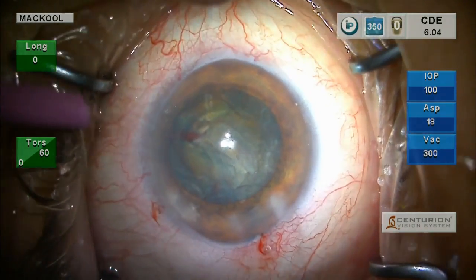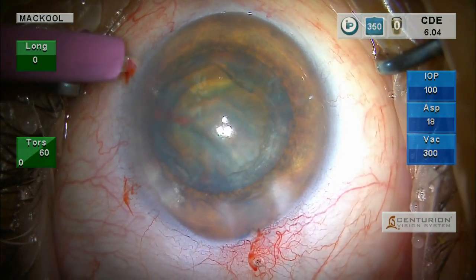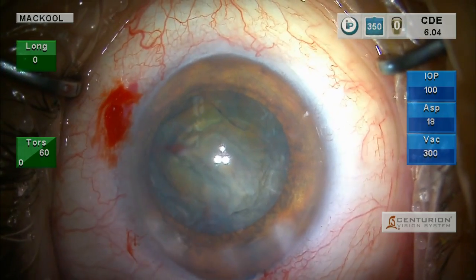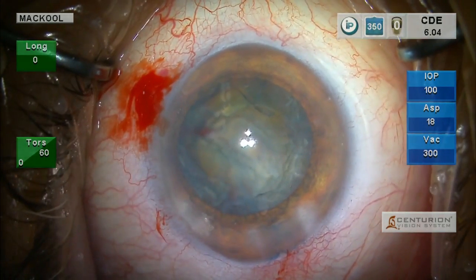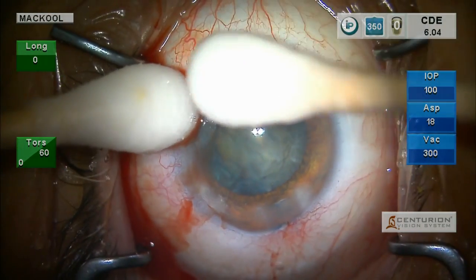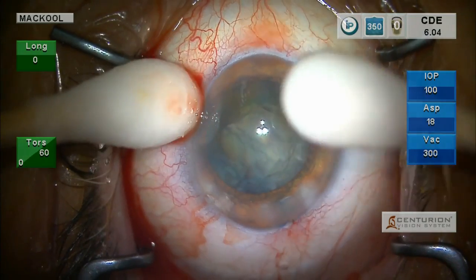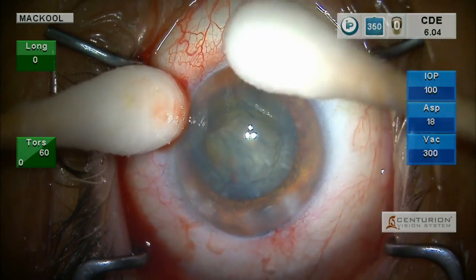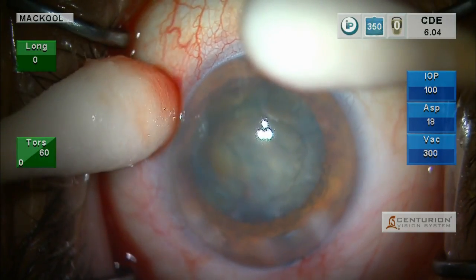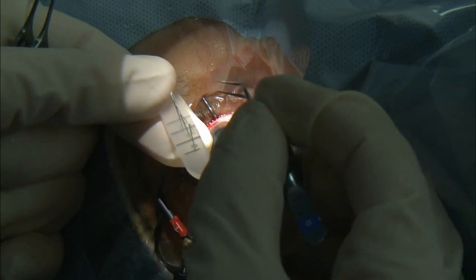I'm going to be using MST retractors here. I use those by making a vertical puncture, then I'll enlarge it a little bit. The patient felt that a little bit, so I'm going to use alcaine on cotton tip applicators — just putting a little more topical anesthetic right where I need it, holding it in the locations where I'll probably put in capsule retractors. I had to go through the conjunctiva superiorly because it's overgrown the limbus, and when I made the side port opening I made it a little bit larger so I can get through the conjunctiva with the retractors.